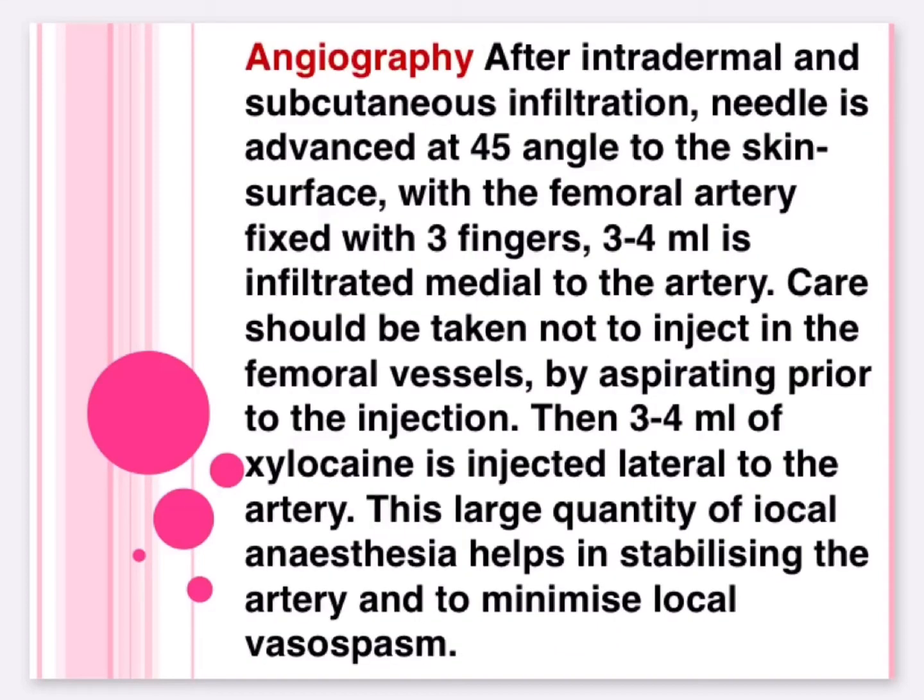Angiography procedure. A. After intradermal and subcutaneous infiltration, the needle is advanced at a 45 degree angle to the skin surface with the femoral artery fixed with 3 fingers. 3 to 4 milliliters is infiltrated medial to the artery. Care should be taken not to inject into the femoral vessels by aspirating prior to the injection. Then 3 to 4 milliliters of xylocaine is injected lateral to the artery. This large quantity of local anesthesia helps in stabilizing the artery and minimizing local vasospasm.